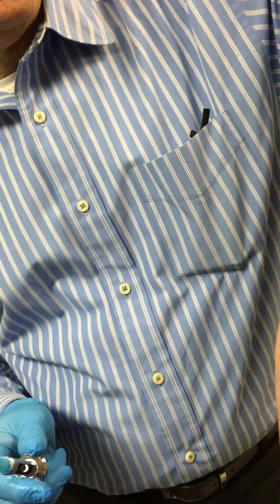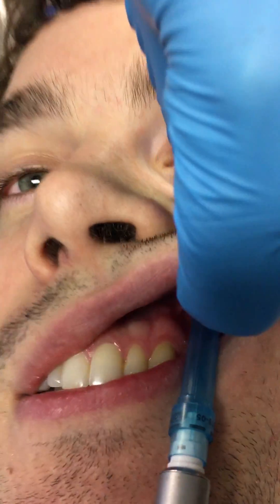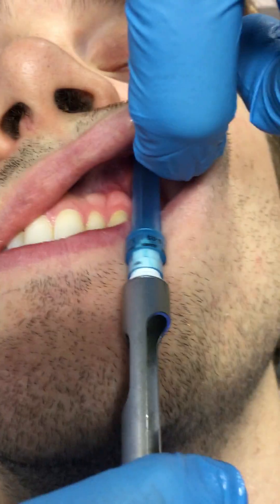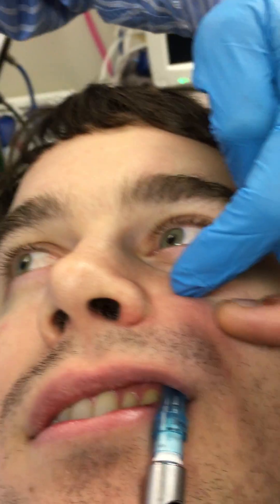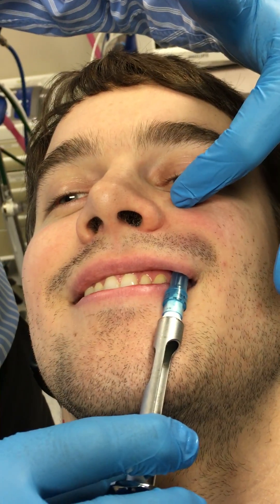So if I was going to give an infraorbital nerve block, I'm palpating the notch like that. I'm going to come in from the canine/first bicuspid area, just like that. Look how high up we are. People think, oh my God, you're going all the way — you're not going far at all. It's nothing. You're talking about like another centimeter, and you're already there. It's not that different.